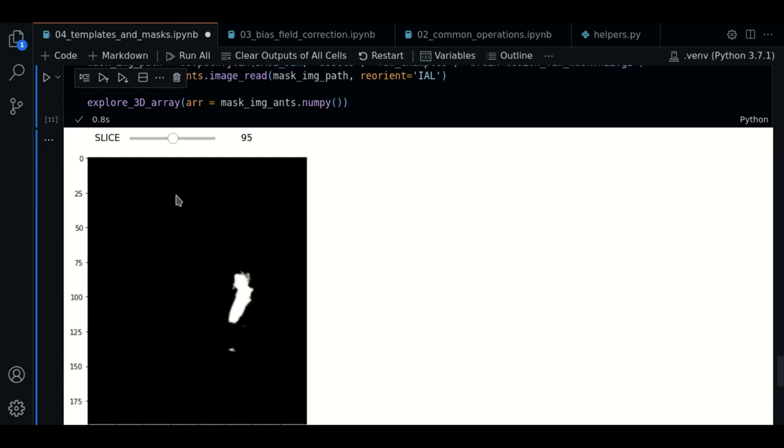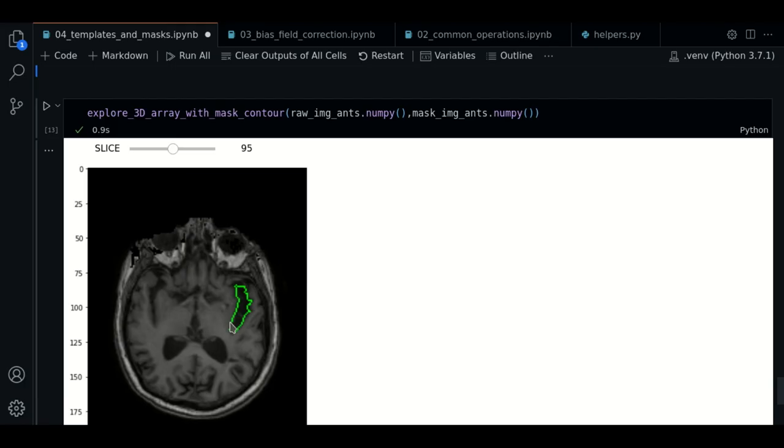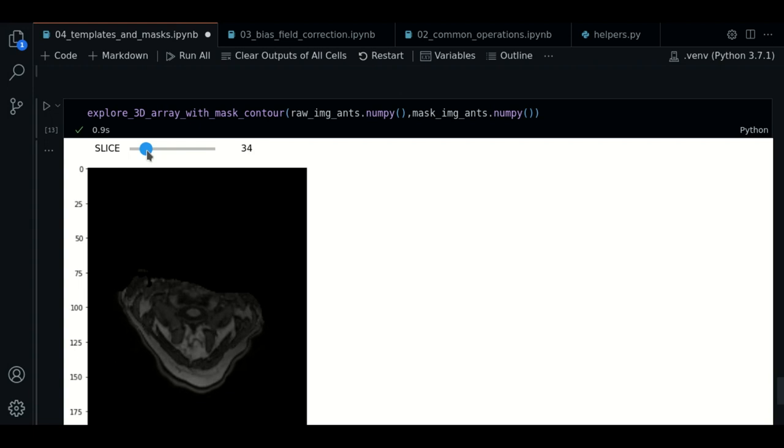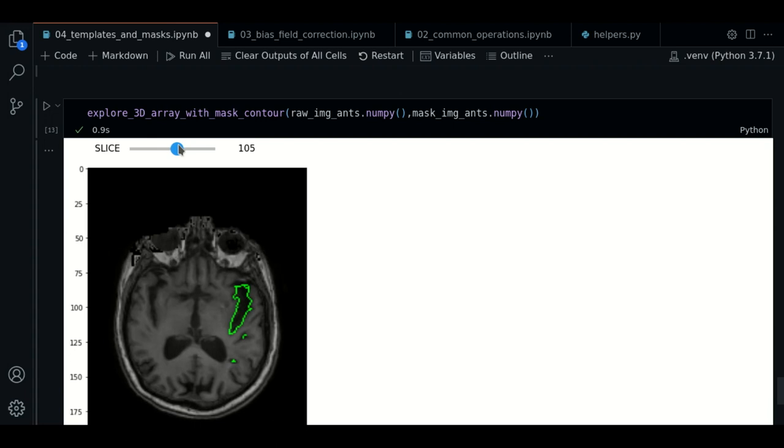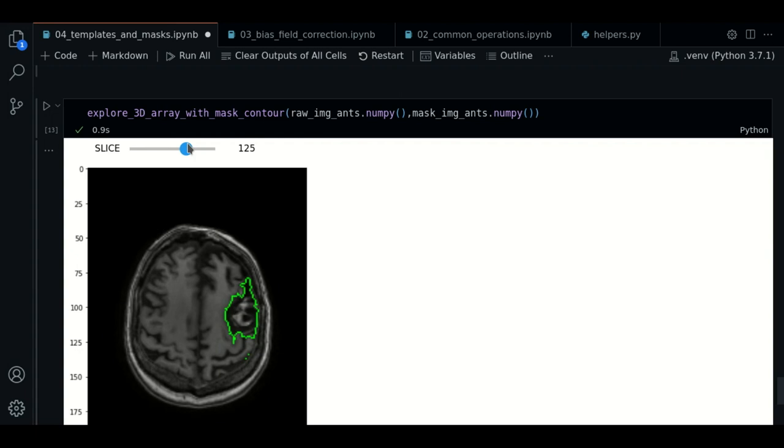It is a bit hard to make sense of this image if we compare it with the brain mask of the template. So here is where the function explore3darray with mask contour comes to be very useful. As you can see, now we have the raw image with the contour of the brain lesion of the mask. We explore a few slices, and we see how it's very convenient to use this function.